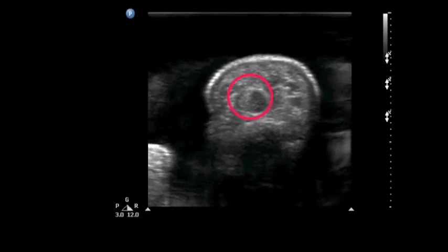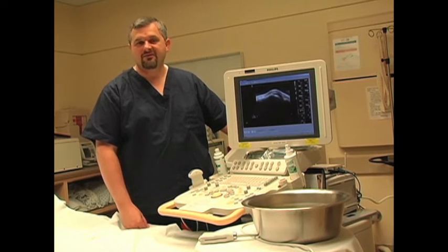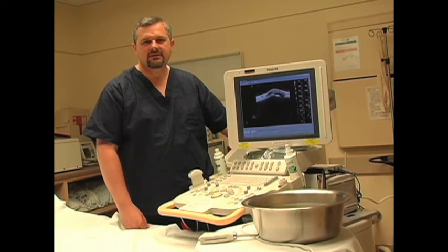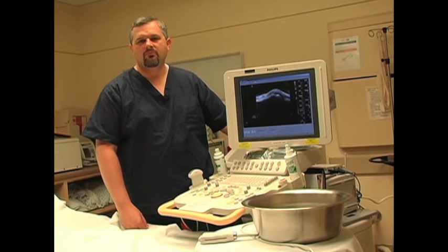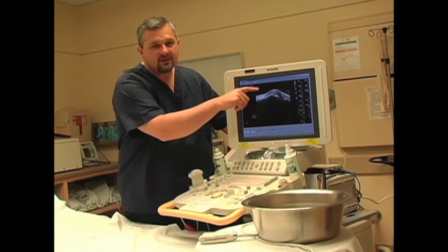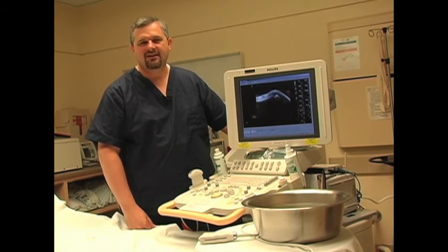Scanning up and down the finger in short axis, the tendons appear as fibrous bundles just above the bright white bone. As we've seen, the water bath is a powerful tool to help us obtain high resolution images of small parts such as the hand or the finger. In addition, patients benefit from minimal discomfort. Keys to remember are probe orientation, as well as adequate spacing between the probe and the finger, and looking for opportunities to use this powerful technique. Thank you very much.